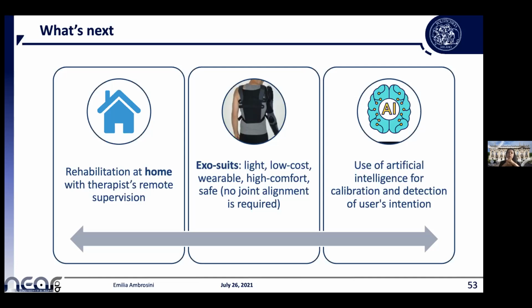Really, the main goal that we should have, in my opinion, is that we should be able to integrate the two technologies at the low level. What I was trying to mention before was in the hardware part, we should avoid asking the physiotherapists to wear two different technologies.